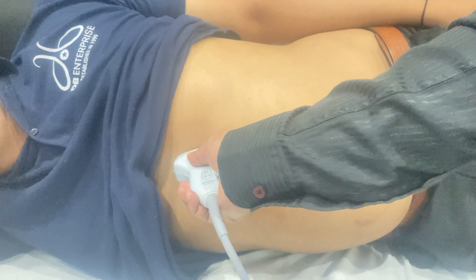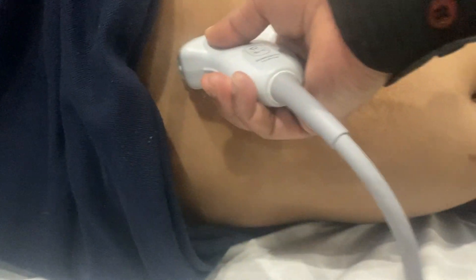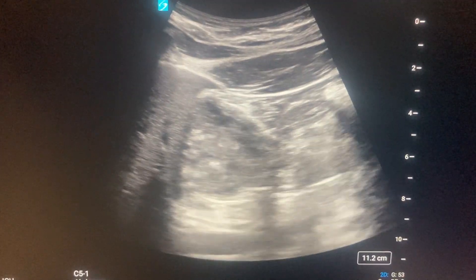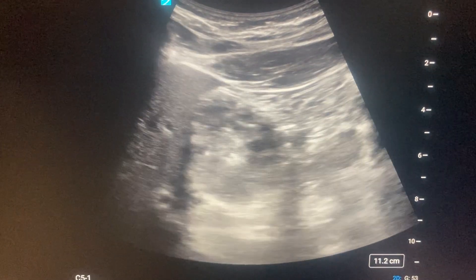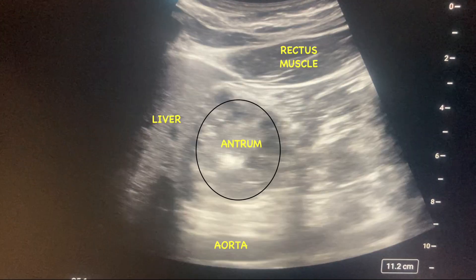I have placed the low-frequency curvilinear probe in the epigastric region in right lateral decubitus position. Here you can see the heterogeneous appearance of solid gastric content that is mixed with anechoic or hypoechoic fluid.